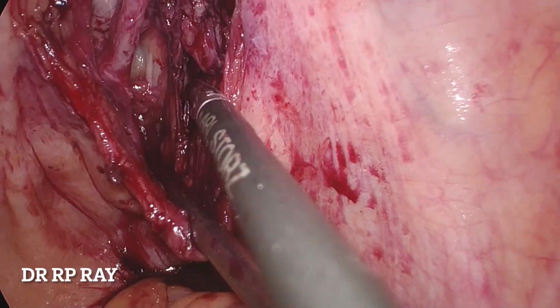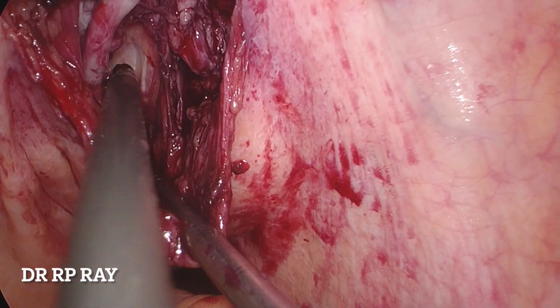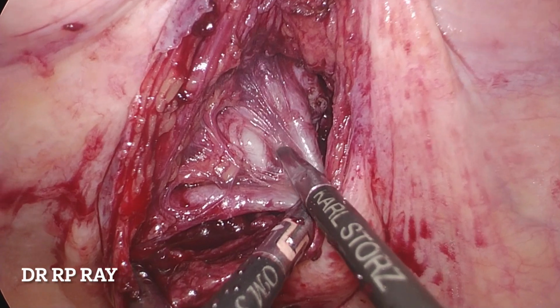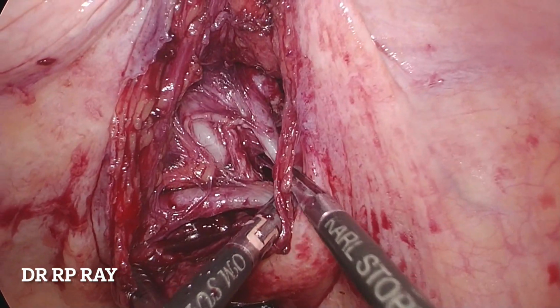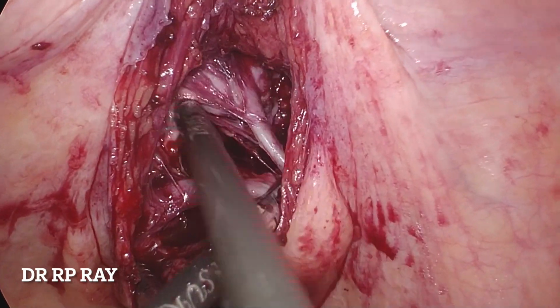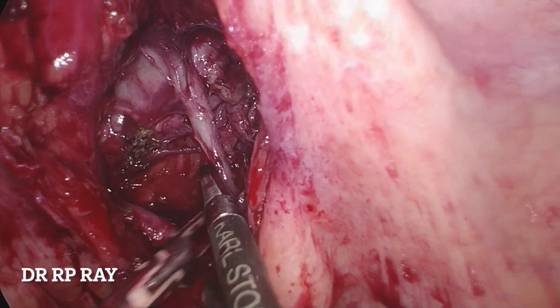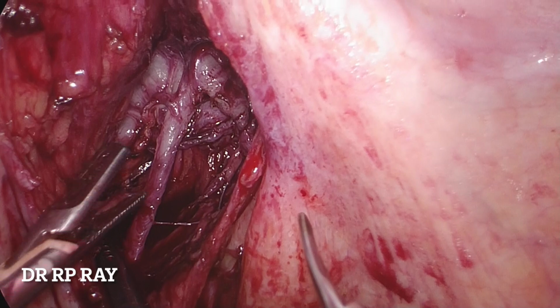Similar dissection is continued on the left side. You catch hold of the left vas and then try to dissect the surrounding structure. You can identify the left seminal vesicle and this is dissected. There is small bleeding as seen on the right side and that is cauterized with the diathermy.